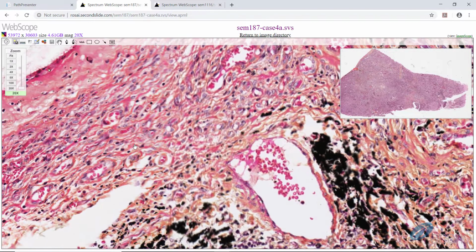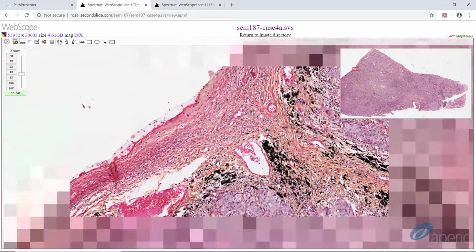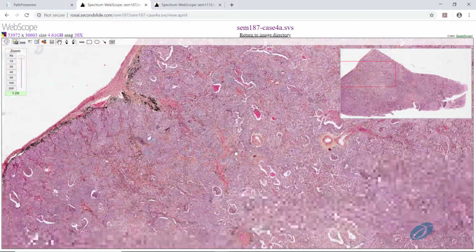This specimen does have an abnormal yellow look because this is a specialized type of stain, probably hematoxylin eosin with saffron or some other type of stain, which gives a yellow appearance. However, it doesn't matter much for the interpretation of the tumor. So let's take a look at the tumor.